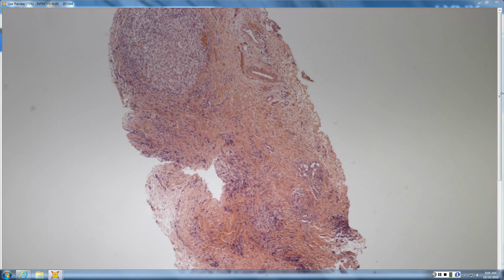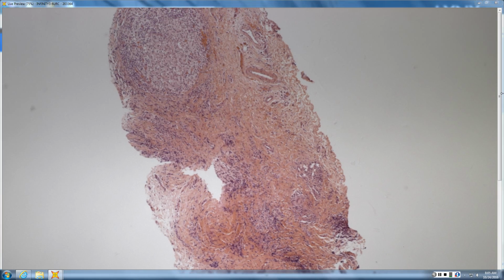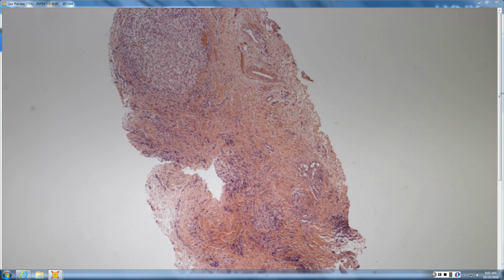The minor salivary gland, the key is you are injecting on the mucosal side to do anesthesia, and then you are going in with your iris scissors and you are spreading tissue, never snipping, and then you are squeezing, and out pop these little round looking pearls that look like little lumps of fat, but they're kind of firm, and those are your minor salivary glands, and you just pop them out and put them in a bottle. And we do that looking for Sjogren's, and we do it looking for amyloid.